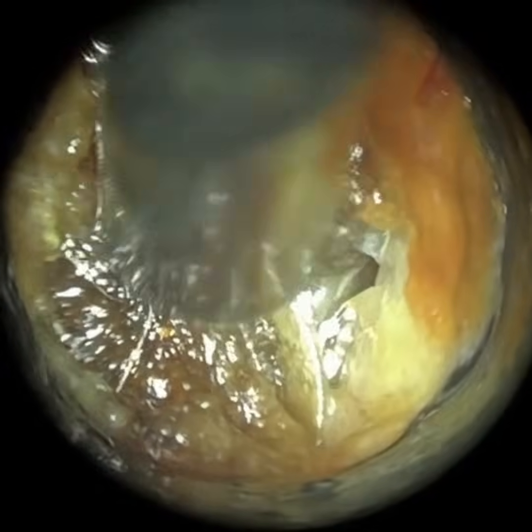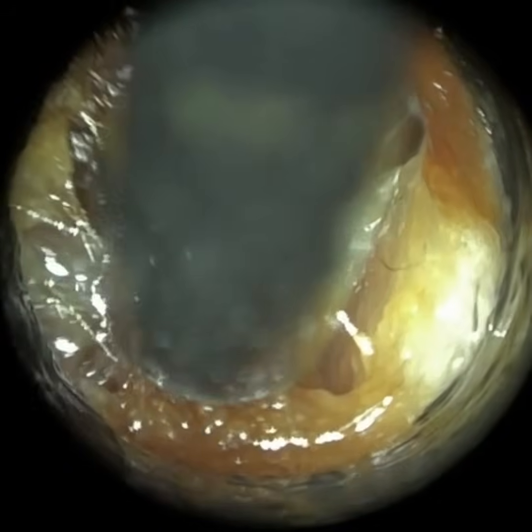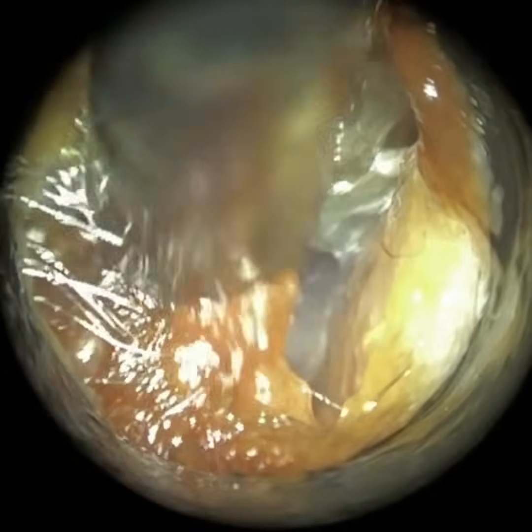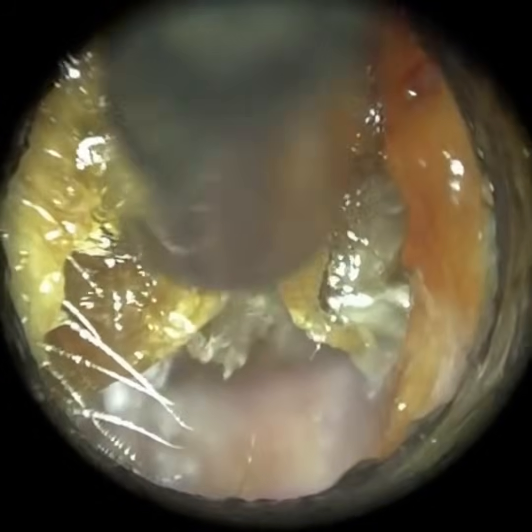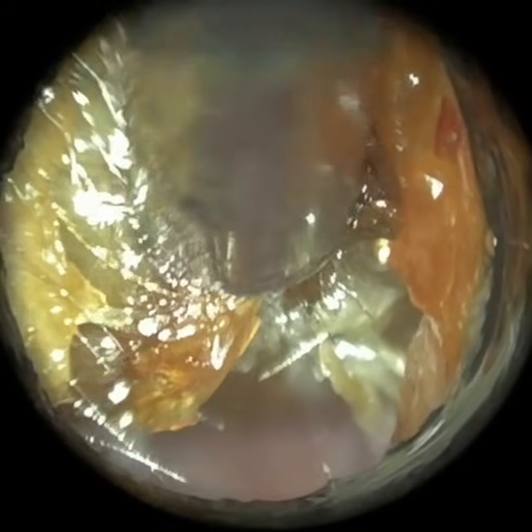So this is quite an interesting case, and in the next few days, I'm going to upload very similar cases. It's of a patient who attends periodically every year, and they have the most prominent anterior recess. The anterior recess is a widening at the front part of the ear canal adjacent to the eardrum. And most of us have an anterior recess.